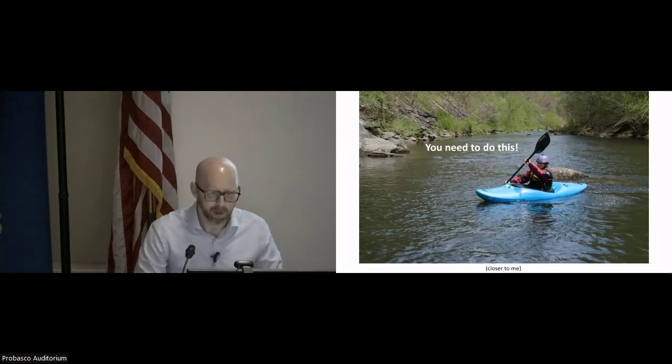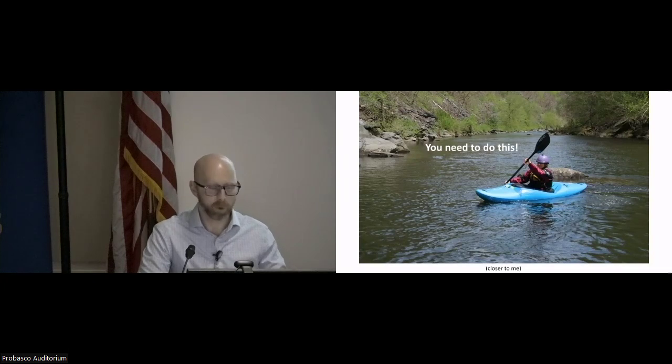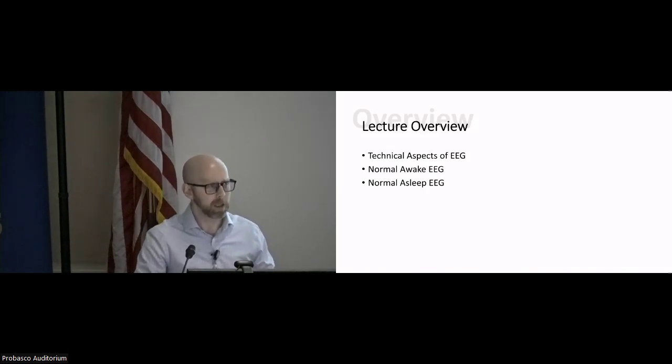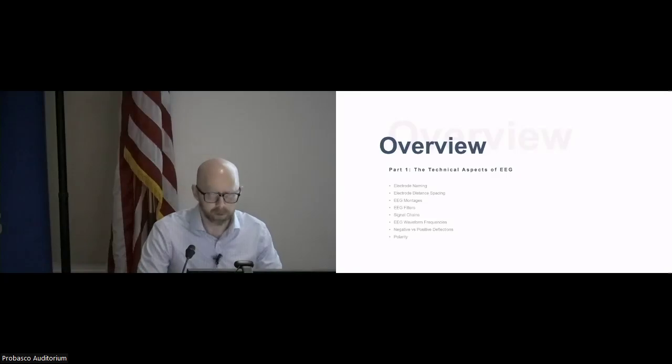And so that's what we're going to do today, learn more of the basics. We're going to cover the technical aspects of EEG, normal awake EEG, and normal asleep EEG. The lecture is designed a little more for people who have never read EEG or have read it only briefly, to get a better feel for what is even happening. So part one will cover the technical aspects of EEG.